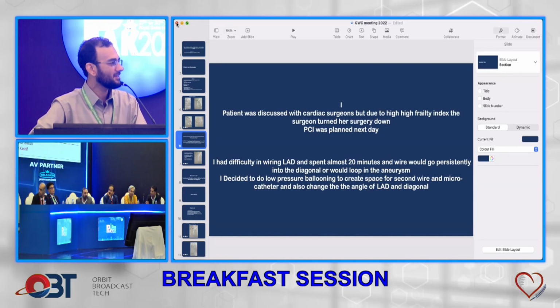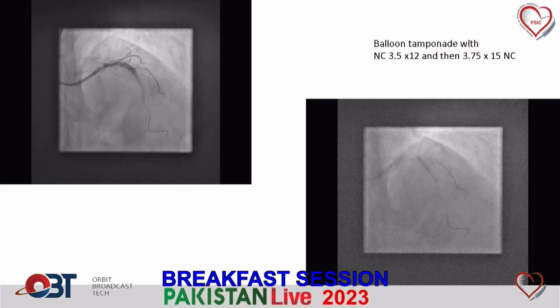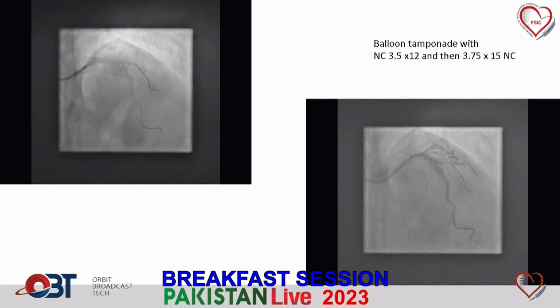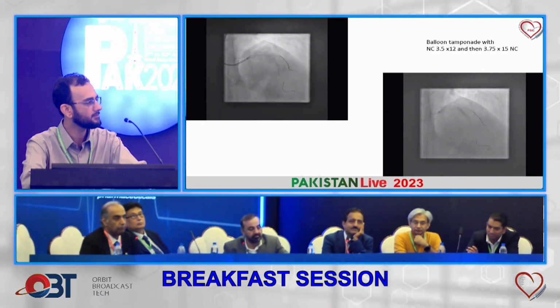So I think let's stop here. So what should we do? You see over here, it is quite clear that the perforation is coming from the point of junction. When you have these points of junction, you try and, of course, put a balloon over here and seal up the vessel. Once you have sealed up the vessel at a good pressure, then you give a small dye injection and make sure that you have actually sealed it, because many times when you take down your balloons, you are not sealing the whole place. And once you have got it sealed, then you wait out your time.